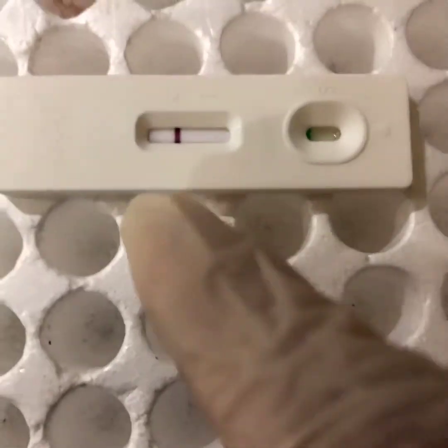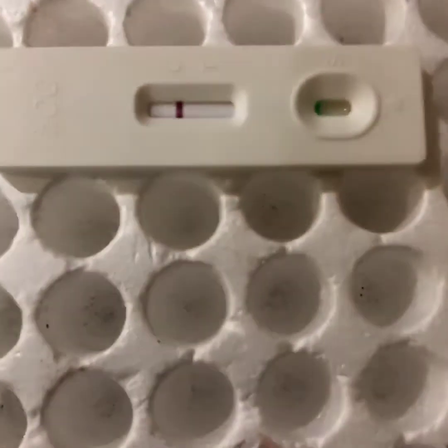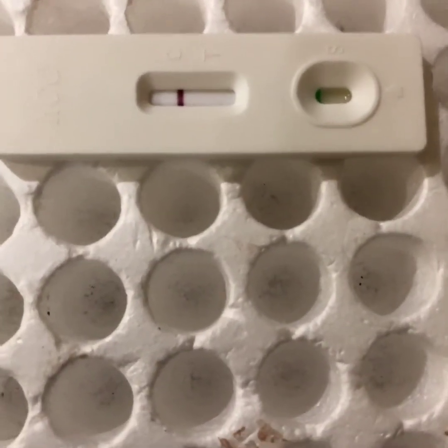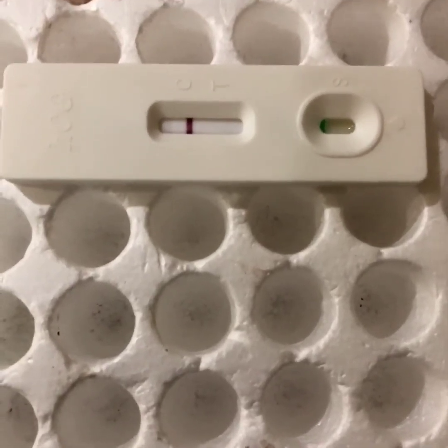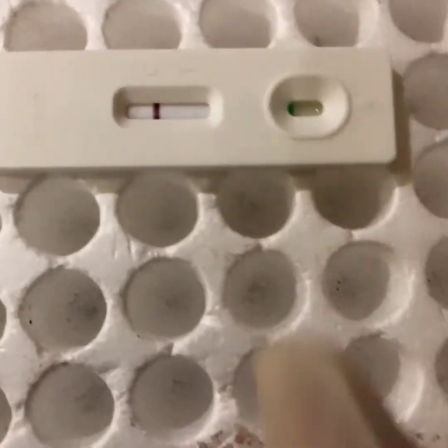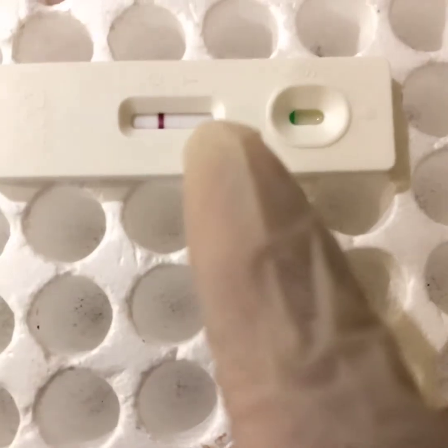That's why a control is incorporated, to check the validity of our testing process. For the interpretation, we have T for the test.